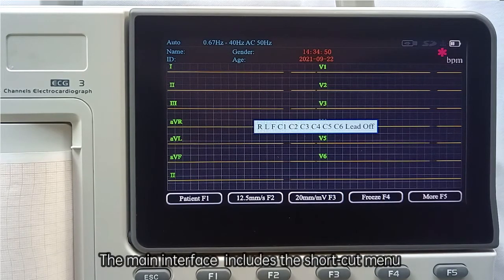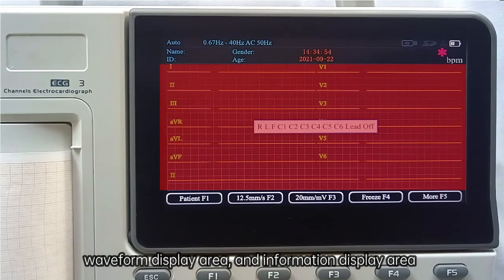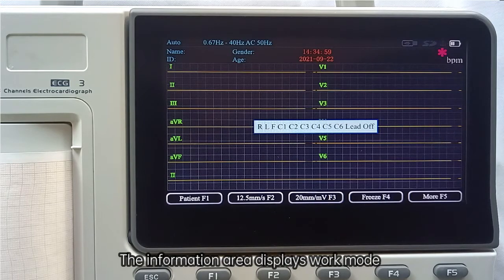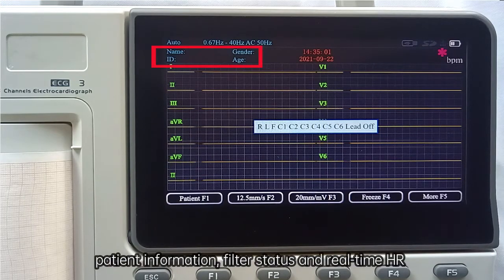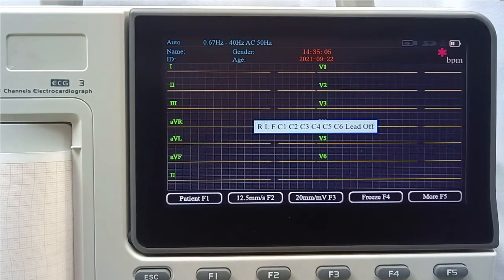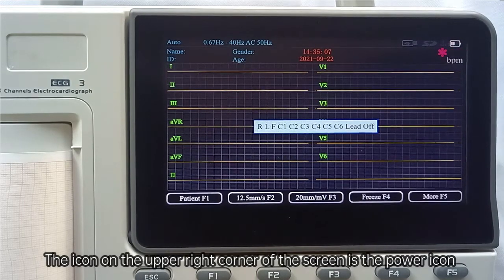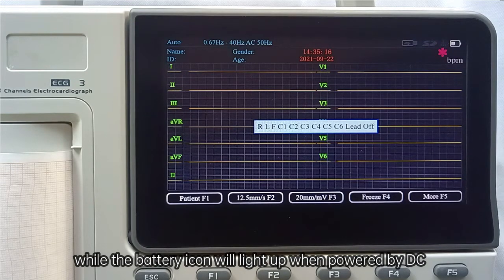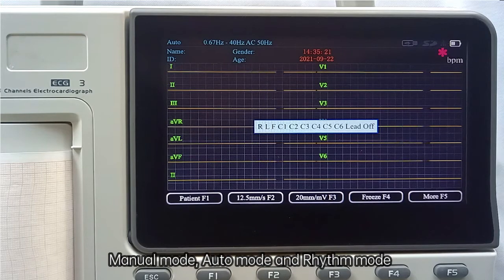The main interface includes the shortcut menu, waveform display area, and information display area. The information area displays work mode, patient information, filter status, and real-time heart rate. The icon in the upper right corner is the power icon — the charge icon lights up when powered by AC, while the battery icon lights up when powered by DC. The available modes are manual mode, auto mode, and rhythm mode.